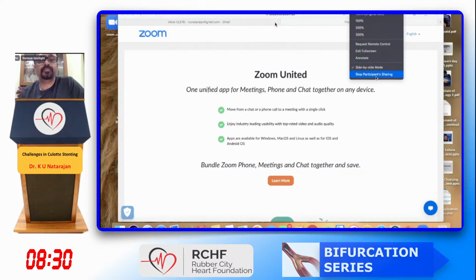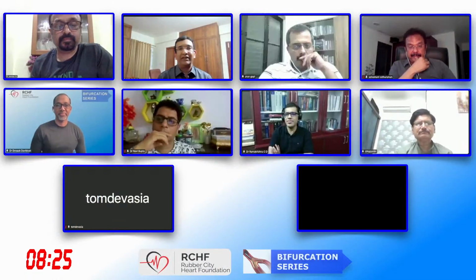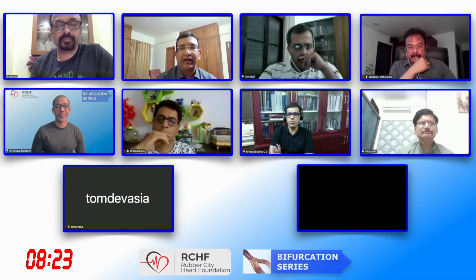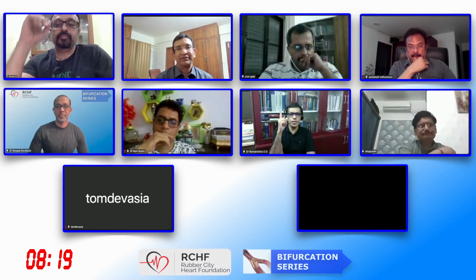That is nice, Dr. Natarajan. You explained all the steps of the Culotte stenting with a nice example. Any questions or any queries from any of the panelists?